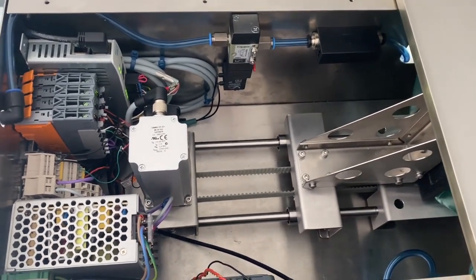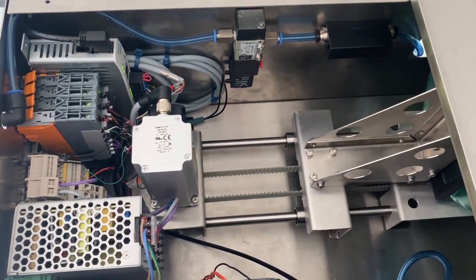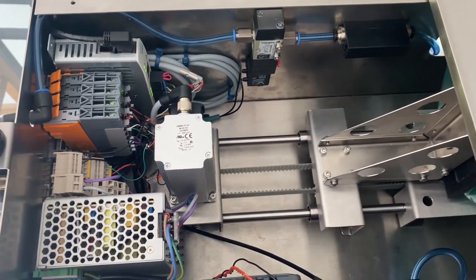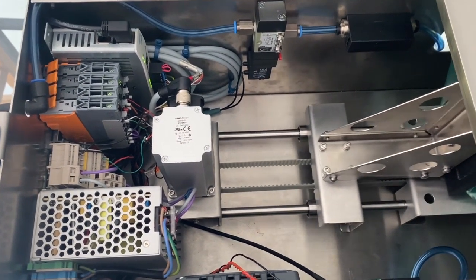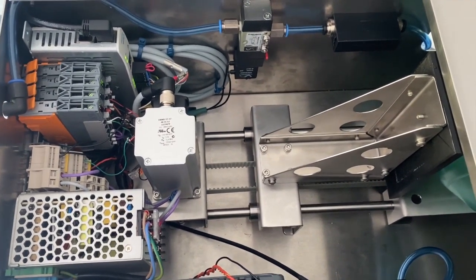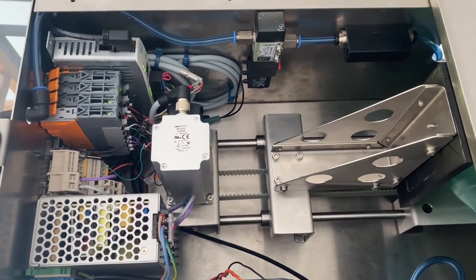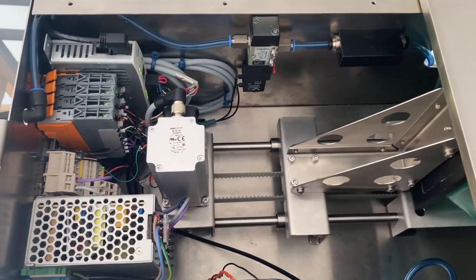Once the fundamental design concepts had been carried out, the detailed design was based around high quality components that had already undergone a considerable degree of field testing. For that very reason, we have resisted the temptation to use our own design of boards and components. If we were setting out on a process to design a ventilator for normal long term production, the result would of course be very different.